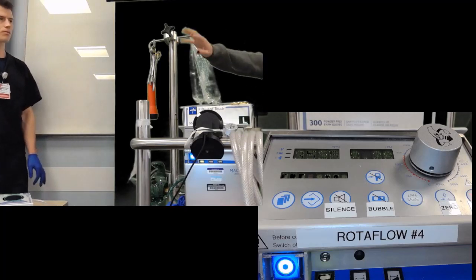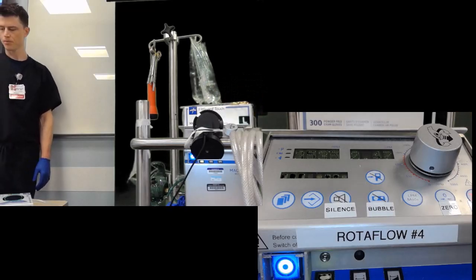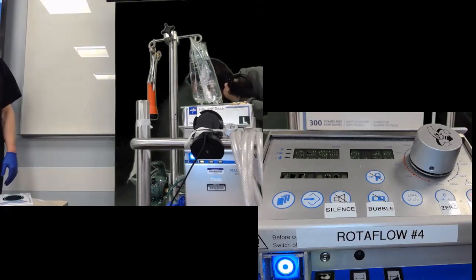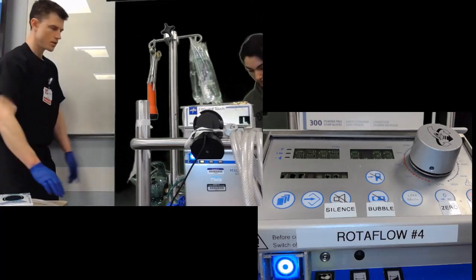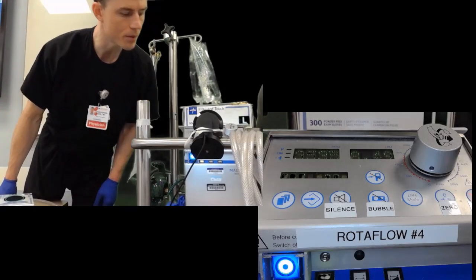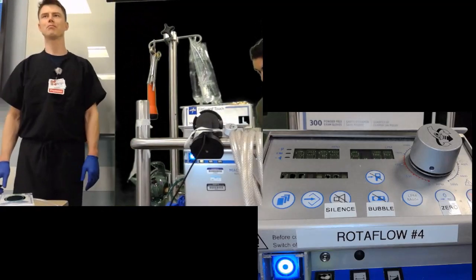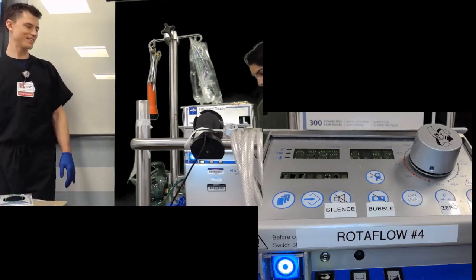I usually start with the patient and work my way back. Already see a kink back here. Good. So you ran your lines, and you saw a kink back there. So what happened with our flow? It went up to 8.5 liters. Good job. Patient saved.